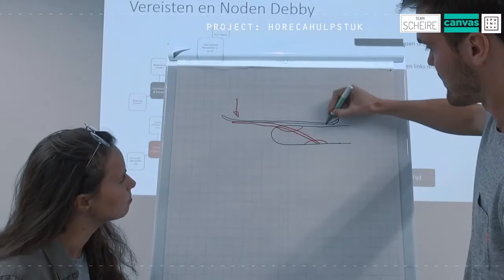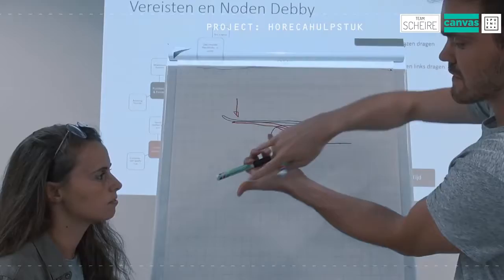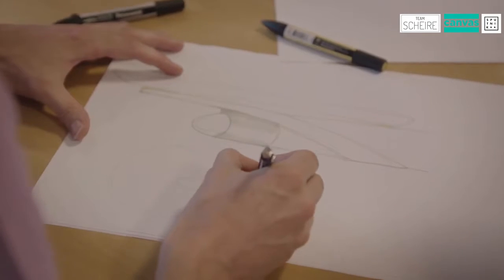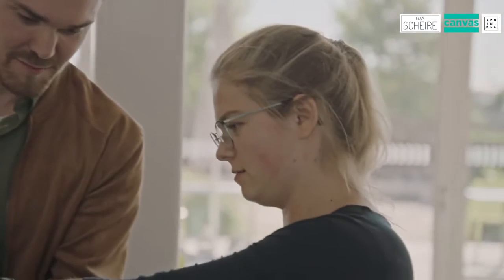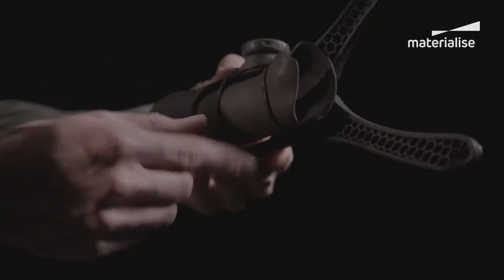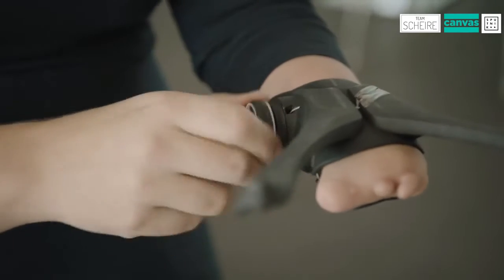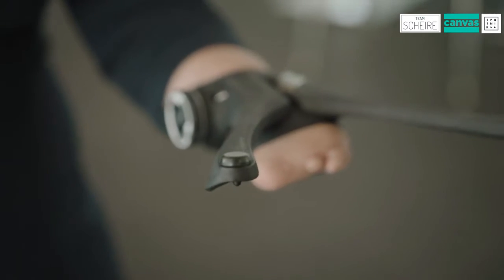Within our first prototype, we noticed that transferring the movement from the arm to the device still was a bit wobbly. There was a bit too much play in between the device and her arm. That's why in our second prototype we chose to make it a bit more complex, because we added an extra fixation in the device. So we added internal channels in the part through which a metal cable goes. Once she puts her arm in there, she can easily turn the knob to tighten the device around the wrist.